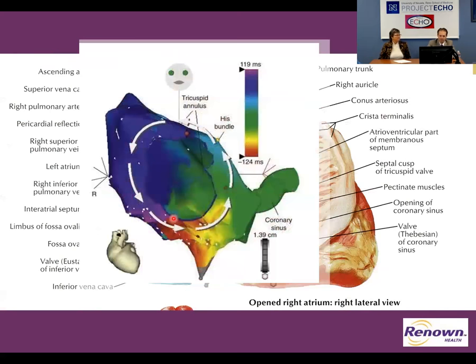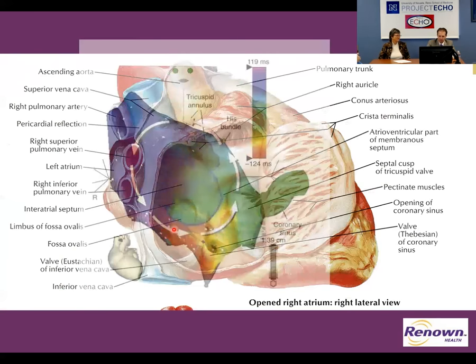In this electroanatomical map, you map the time closer to your catheter. So this is the start of the arrhythmia, this is later on, and this is the very end. That shows you how you map it. But anyways, the idea is the same, that it's a macro-reentrant arrhythmia of the right atrium.